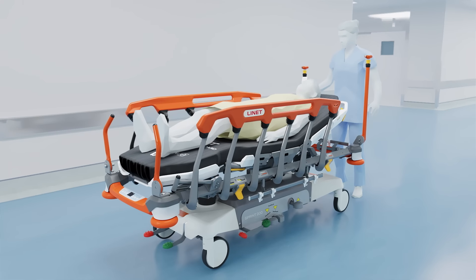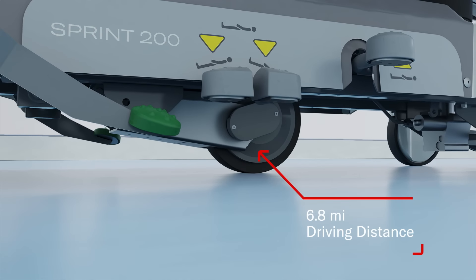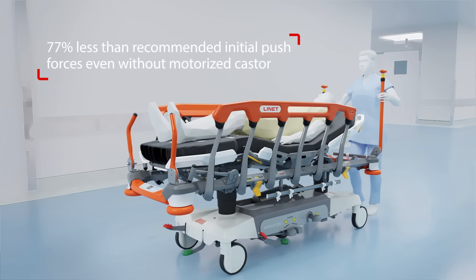Patient transport can present physical burden, but not with the iDrive power. All it takes to drive the Sprint 200 is a push of a button, and thanks to safety sensors, it stops just as quickly when the hand is removed.